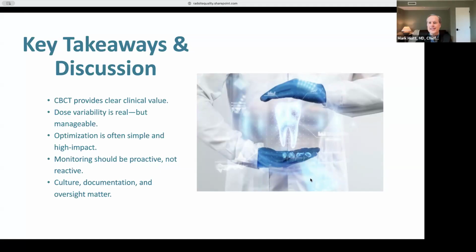Wonderful. Chris? No, I would say that accreditation programs are very important. I've seen the evolution of the Department of Energy's laboratory accreditation, DOELAP, and also NVLAP programs for dosimetry services, where there was one time you could just put your shingle up and become a dosimetry service, and there was no technical requirement or regulatory requirement.